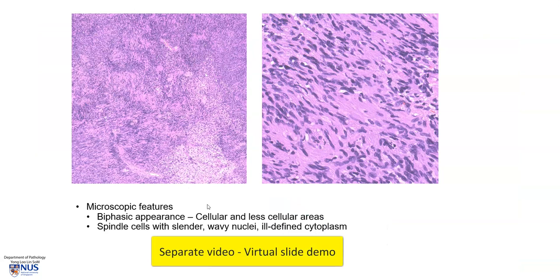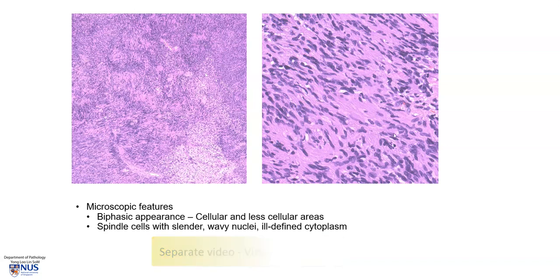There is actually a separate video describing the microscopic features on a virtual microscopy slide. However, just briefly, these tumors have a biphasic appearance, especially the larger tumors — you can see there are more cellular compact areas interspersed with less cellular areas. The tumors are composed of very spindle Schwann cells with slender, wavy nuclei.